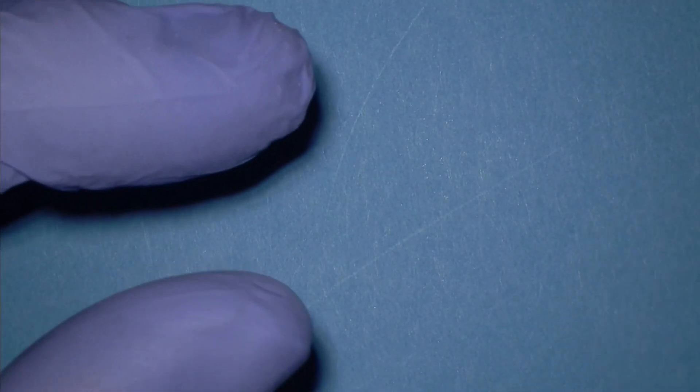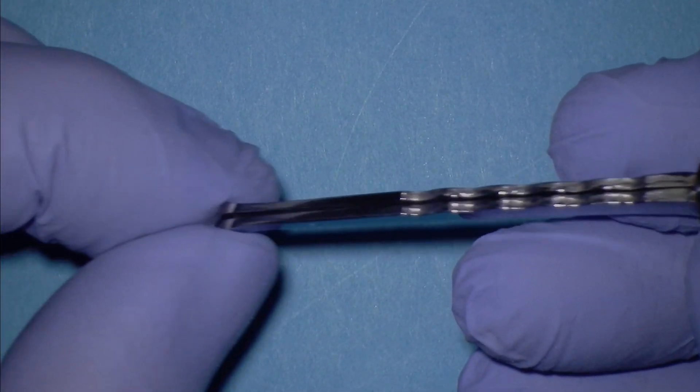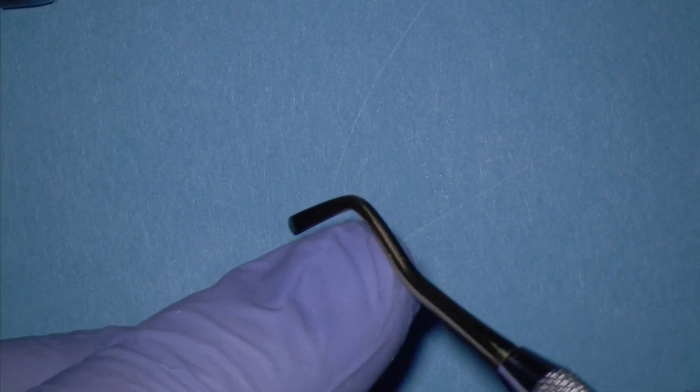For smaller cavity preparations, we will need to use the non-adjustable small end of the push-pull instrument. Then, for extremely small cavity preparations, we'll use the convex end of the Bioclear paddle instrument.